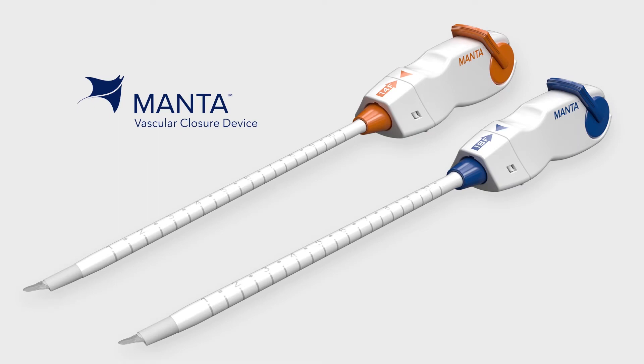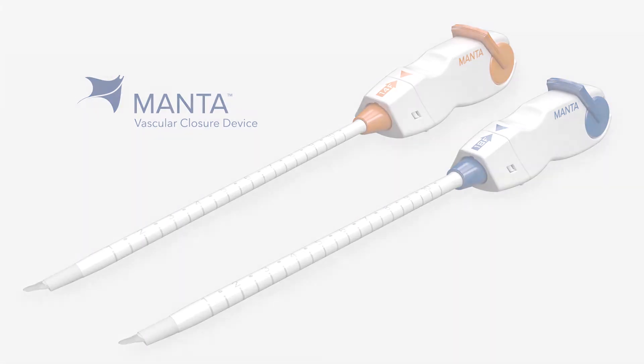Enter a new era in large-bore closure with the Manta vascular closure device, which was designed specifically for closure of large-bore femoral arterial access sites following the use of devices or sheaths ranging from 12 to 25 French outer diameter.